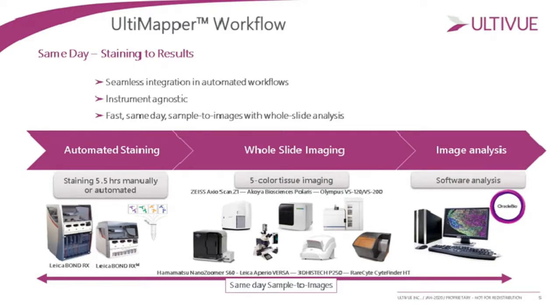Next, we perform whole slide imaging, which depending on the tissue size can take 15-20 minutes. And then the same day, we can already move to image analysis.